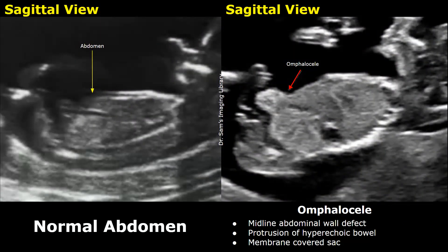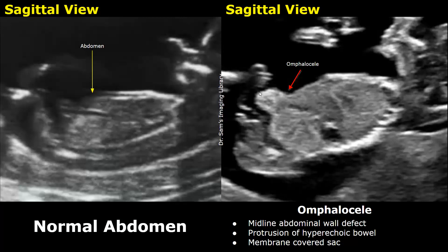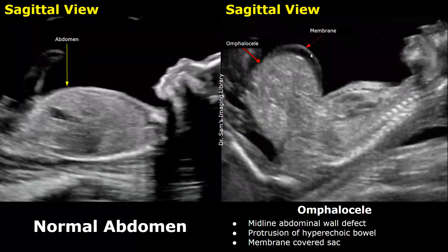A fetus with Edwards syndrome may have abdominal defects as well. The image on the left is of a normal fetal abdomen in sagittal view. An omphalocele is a midline abdominal wall defect that leads to protrusion of abdominal contents such as bowel and even the liver through this defect. Hyperechoic bowel is seen protruding through this defect, forming a sac covered by a membrane. We can also see protrusion of hyperechoic bowel with a visible membrane.